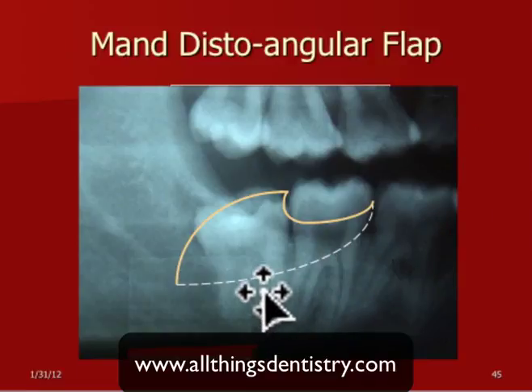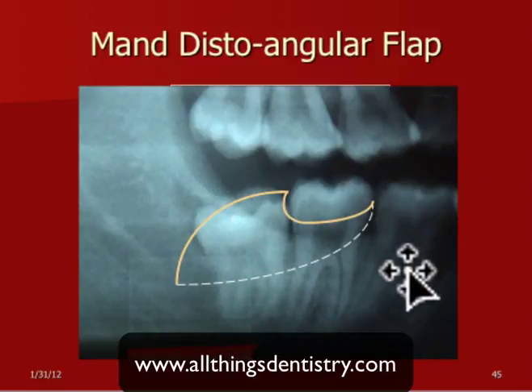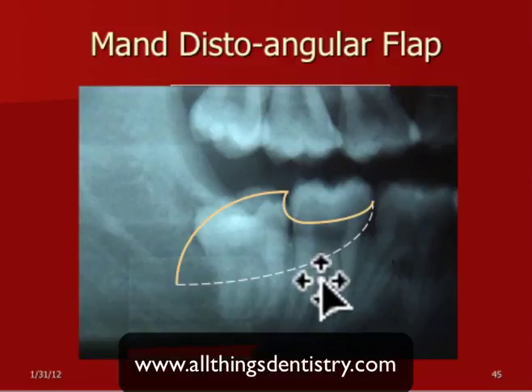You'll see that little bony interseptal bone in there? You'll notice it's kind of an island. It's cut off, but the root tips touch each other. When you see a bony island of interseptal bone, that's almost inconsequential. It's probably not attached to anything. It's really not a consideration as long as your roots are narrower down here than they are at the top. Compare that to the adjacent tooth where you have a long, skinny peninsula of interseptal bone that's connected to the mandible there. That may be a problem.